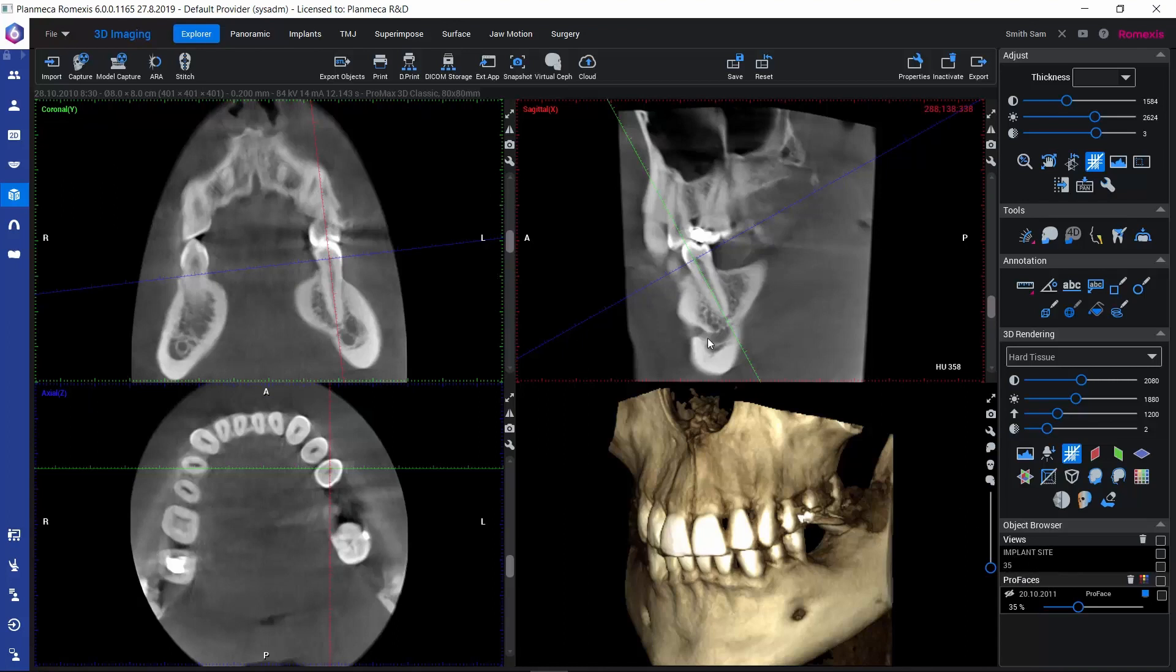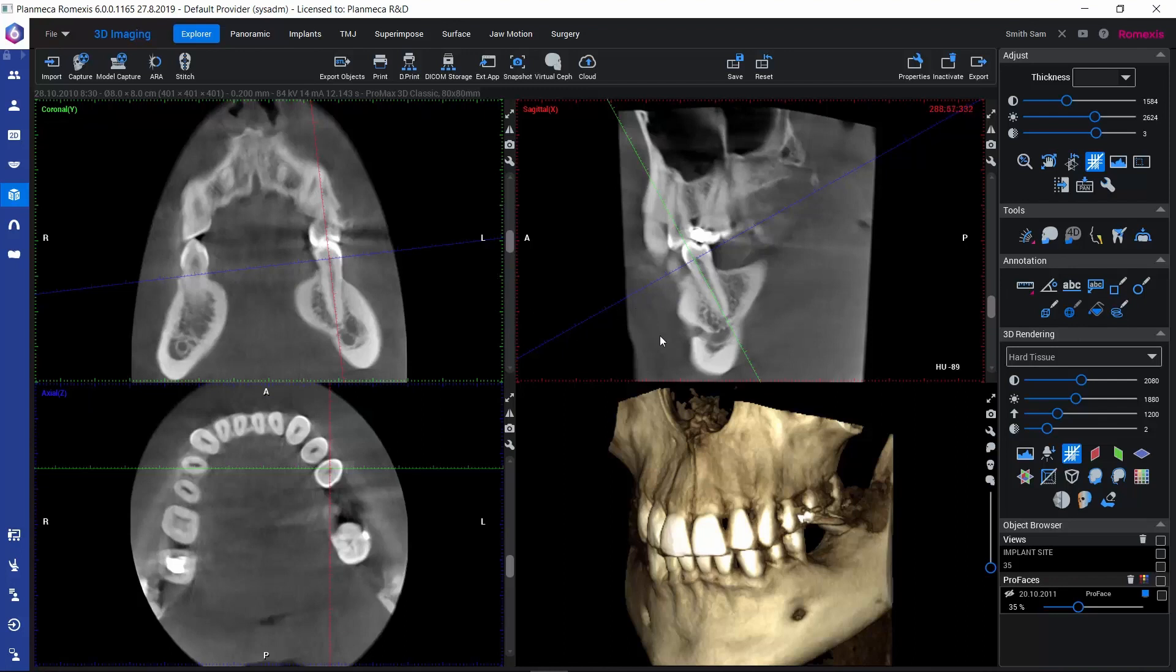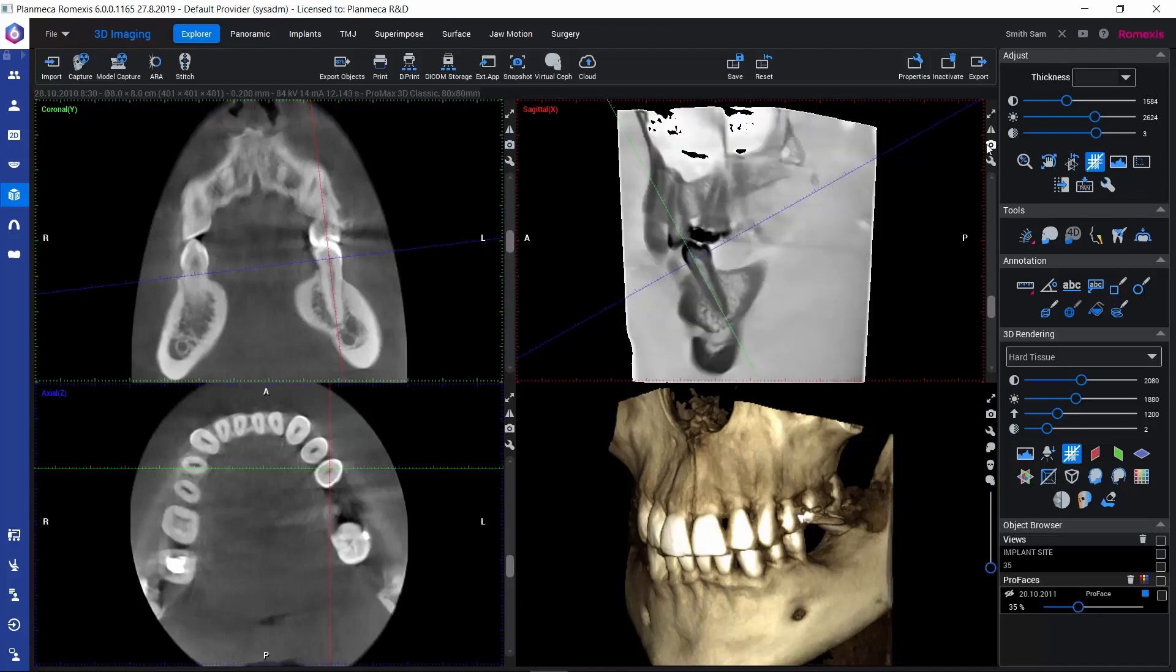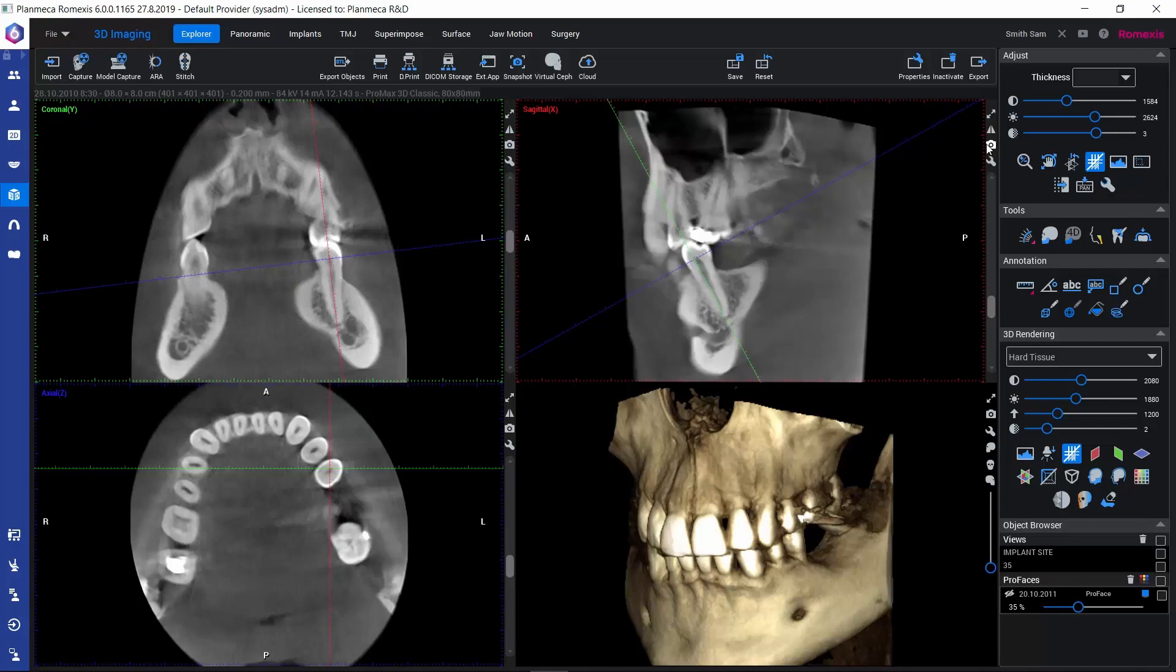Another way of saving findings is to take 2D snapshots of them. We can first add some annotations on the view. Then when we would like to save this as a 2D view, we can use this camera-like icon next to any of these slice views. Also here in the 3D rendered view, we have one. If we click on this, Romexis will save this view as a 2D snapshot in the 2D module for the same patient.